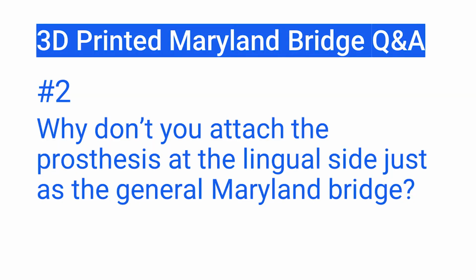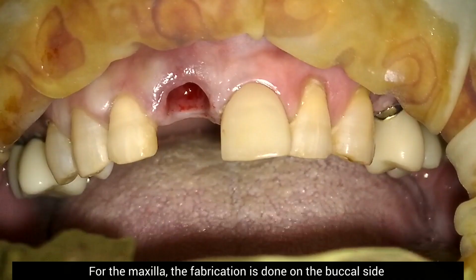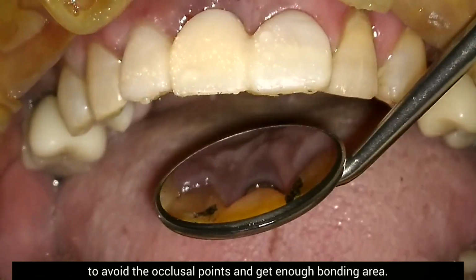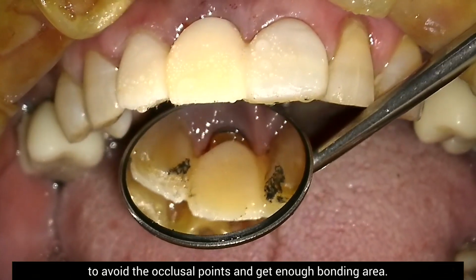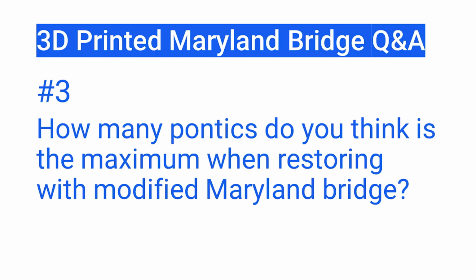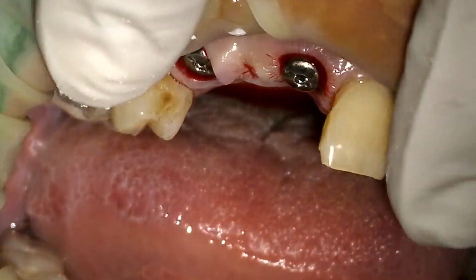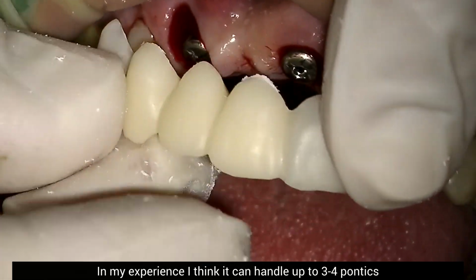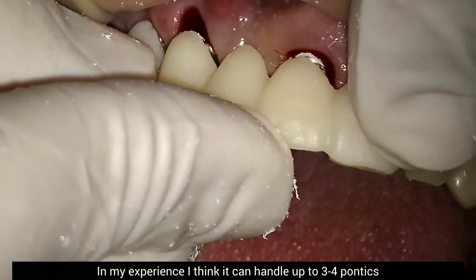Question number 2. Why don't you attach the prosthesis at the lingual side just as the general Maryland bridge? For the maxilla, the fabrication is done on the buccal side to avoid the occlusal points and get enough bonding area. Question number 3. How many pontics do you think is the maximum when restoring with a modified Maryland bridge? In my experience, I think it can handle up to 3 to 4 pontics.